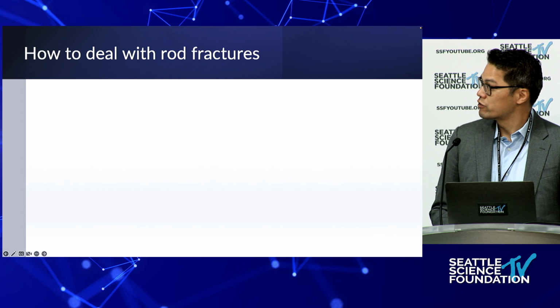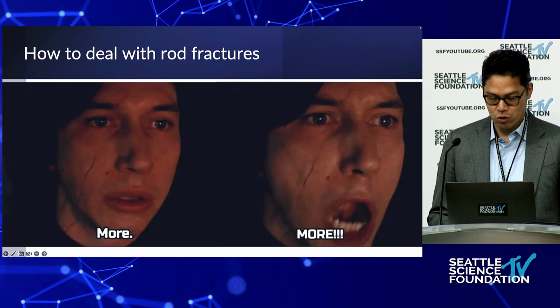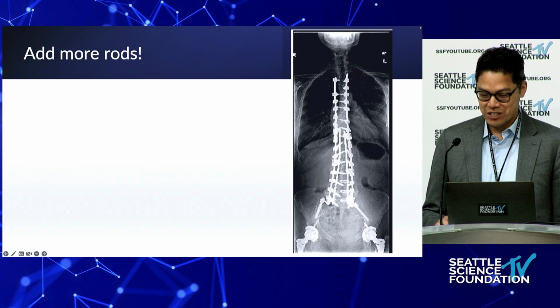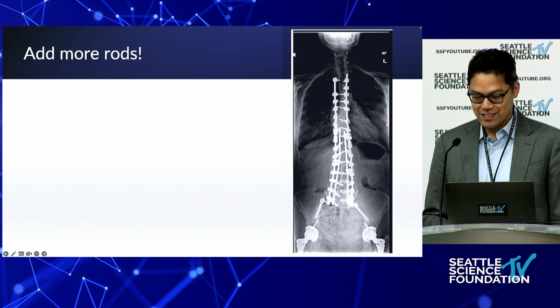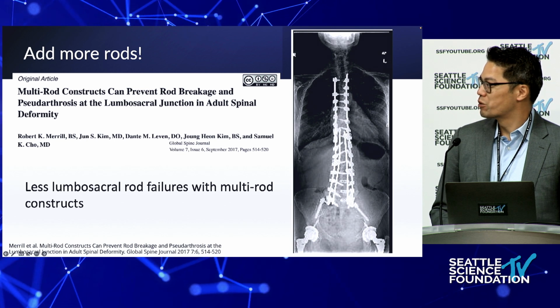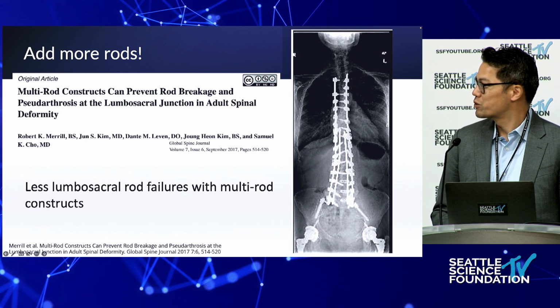So how do we deal with rod fractures? More rods. All right, so we add more rods. So with a quad construct like this, this group showed that there are less lumbosacral rod fractures with multi-rod constructs.